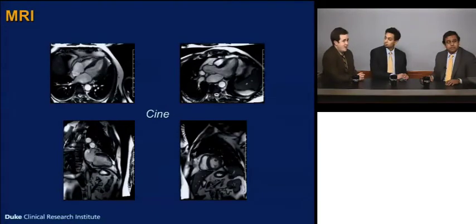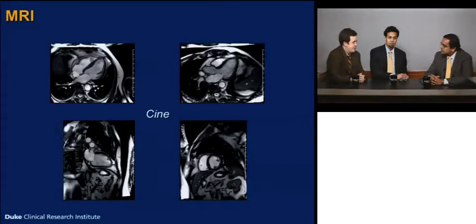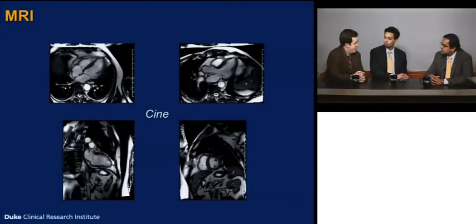Yeah, so I think an interesting comment here is that having an understanding of what you're going to target in terms of information from the test can help. Having a nuclear and an MRI test for the same question is not a common thing. So I think here it's certainly an interesting example of how sometimes tests don't answer every single question for clinicians.